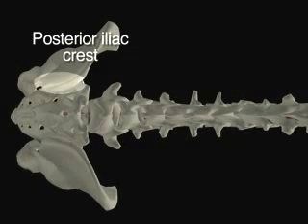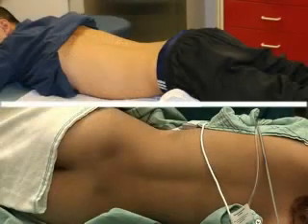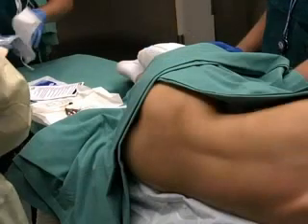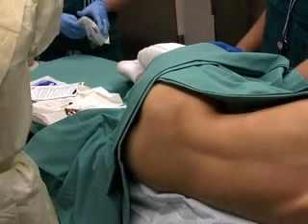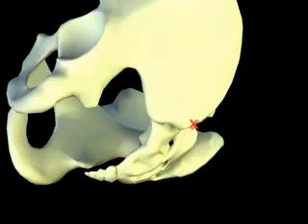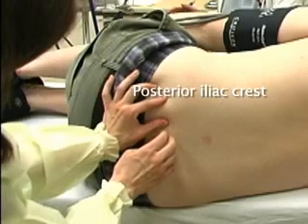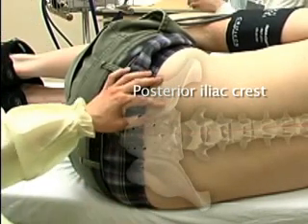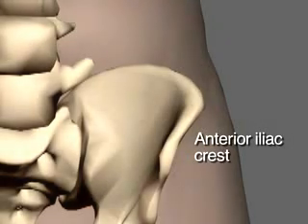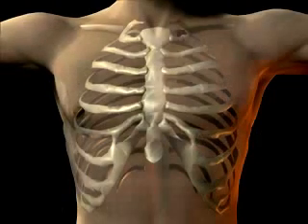The posterior iliac crest is the most common site used to obtain bone marrow. This site can be reached with the patient in either the prone or decubitus position; this video will demonstrate the decubitus position. The patient should be positioned in the right or left lateral decubitus position with knees flexed. The posterior iliac crest is located at the center of the posterior superior iliac spine. With the patient lying on his or her side, palpate the posterior iliac crest. If there is a reason not to use the posterior iliac crest, bone marrow aspiration from the anterior iliac crest may be performed. Though the sternum can be used to obtain a bone marrow aspiration under exceptional circumstances, it is not suitable for a bone marrow biopsy.